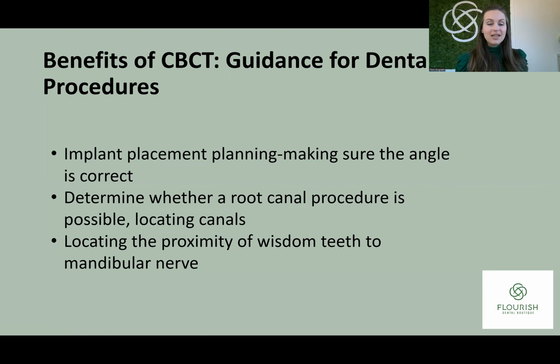Before a root canal, if a patient is going to have a root canal done, many times they will take a CBCT to determine if there are things going on in the tooth that would make a root canal not possible, or make it less likely to succeed. And then they can look ahead of time and see if there are any canals that might be difficult to spot or might be hiding.